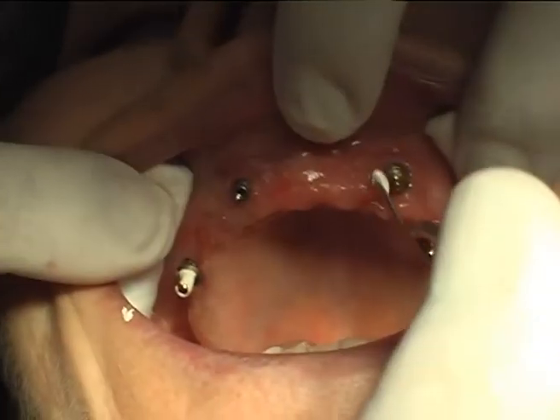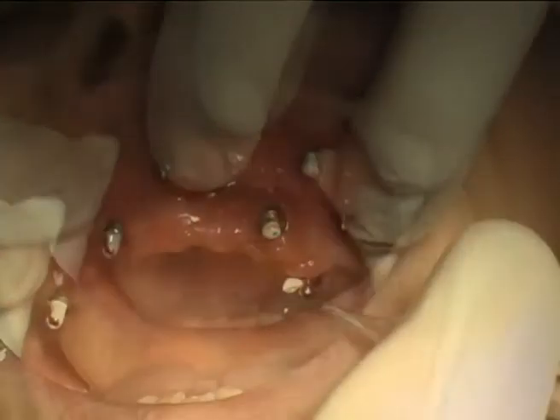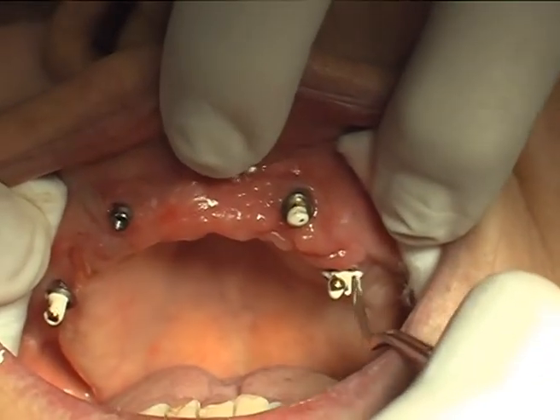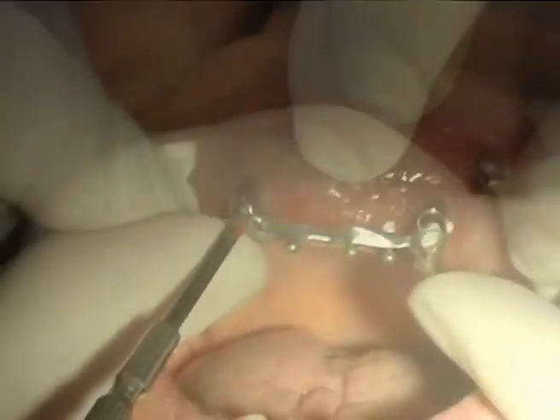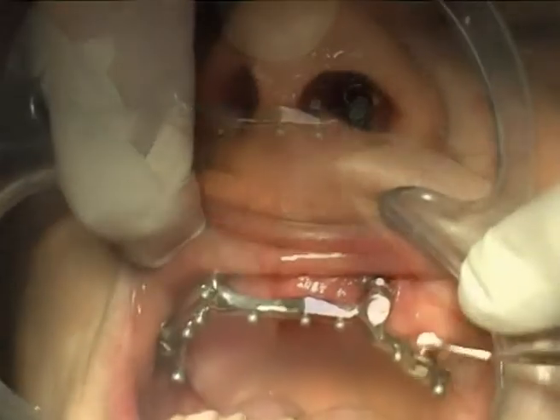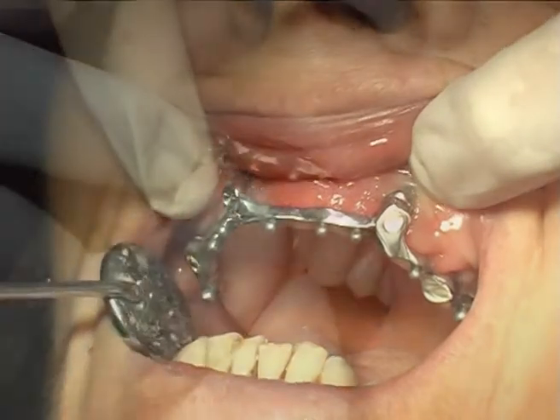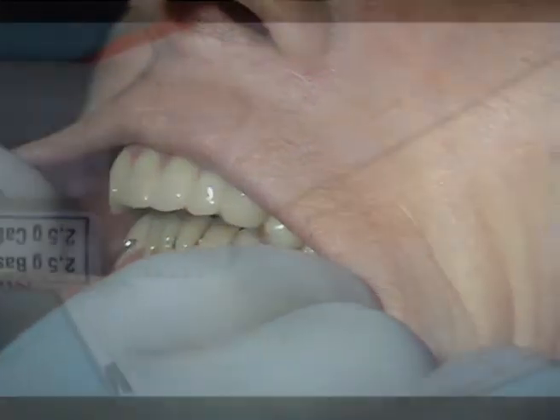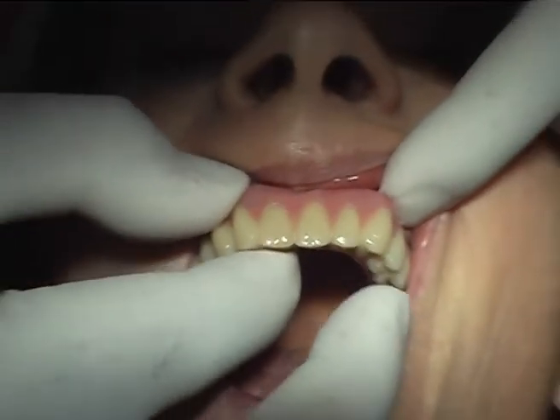Use a dual paste, non-light curing composite to cement the bar to the spherical attachments. Spread the spheres with some cement, insert the bar, and tighten the screw. Completely fill the annular rings with the rest of the cement, even pressing it inside if necessary. Have the patient bite down on the denture while it is in place, and keep it firmly in place until the cement cures. Remove the denture, refine and polish the cement.